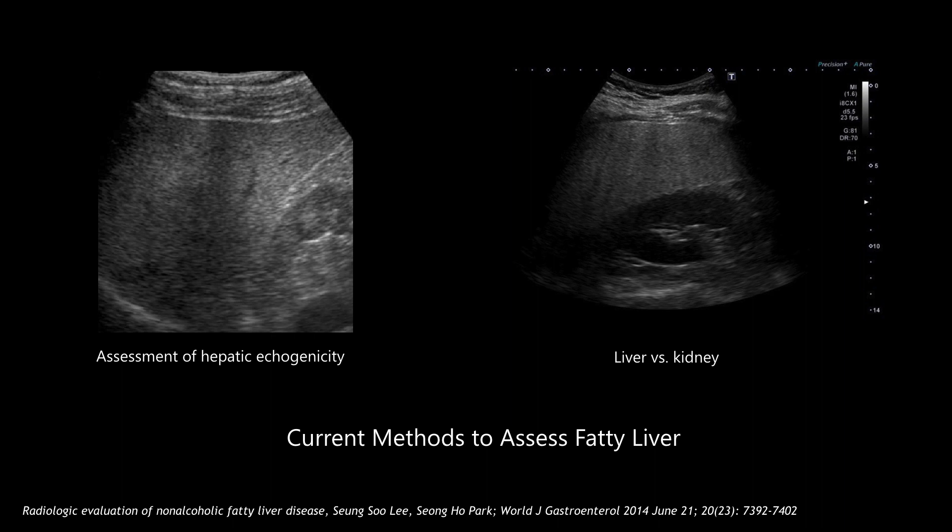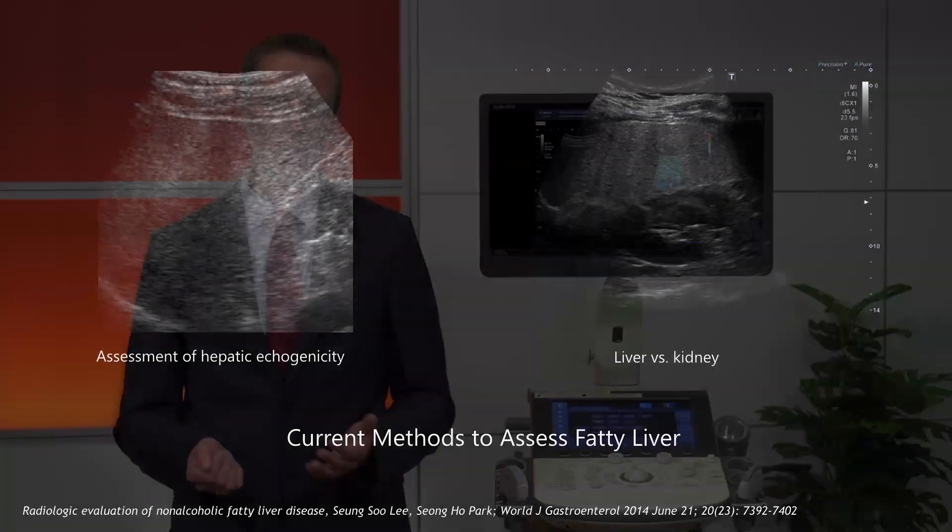However, these techniques are subjective, operator-dependent, and generally lack the sensitivity required to assess mild steatosis. Attenuation imaging is a quantitative method for the assessment of steatosis, uniquely available on the Canon i-Series ultrasound systems.